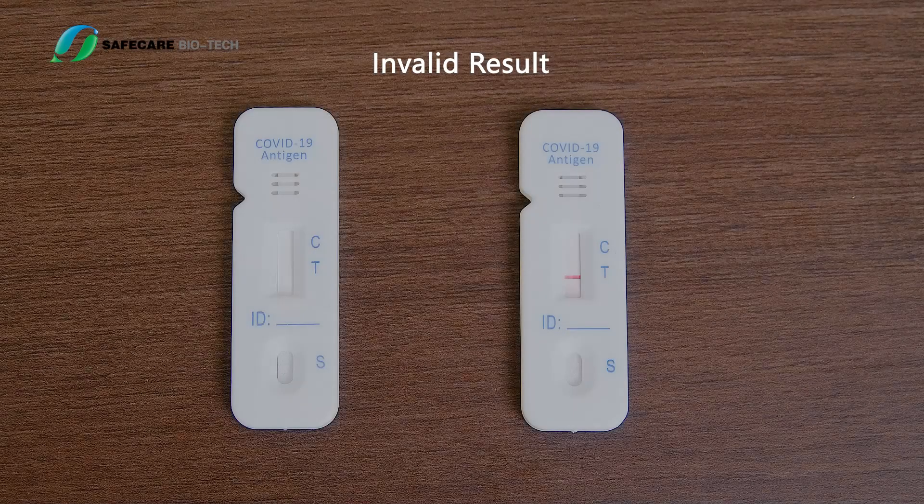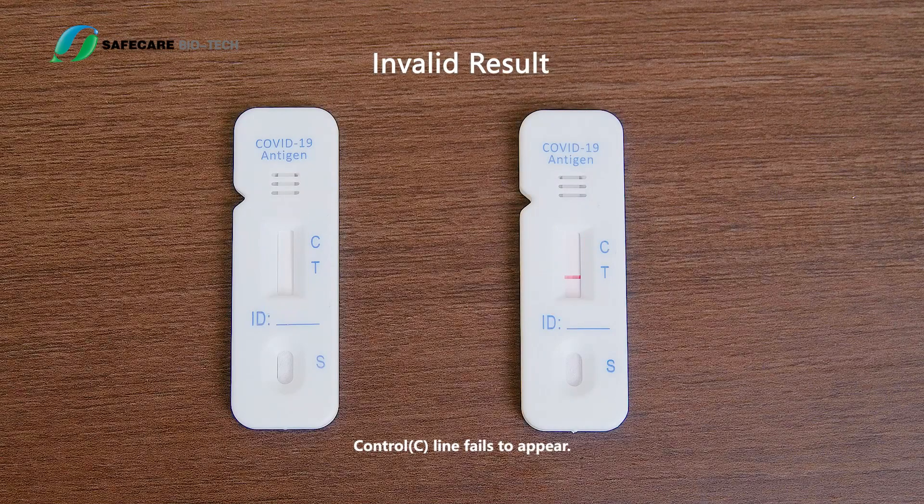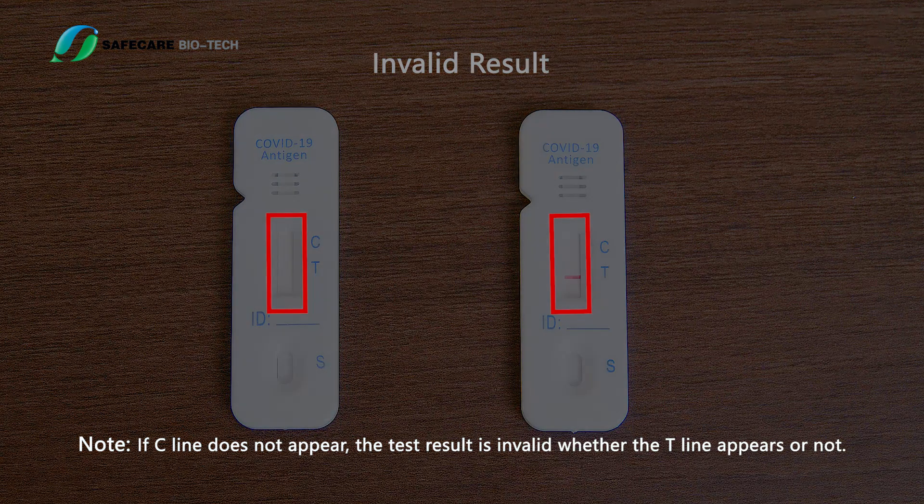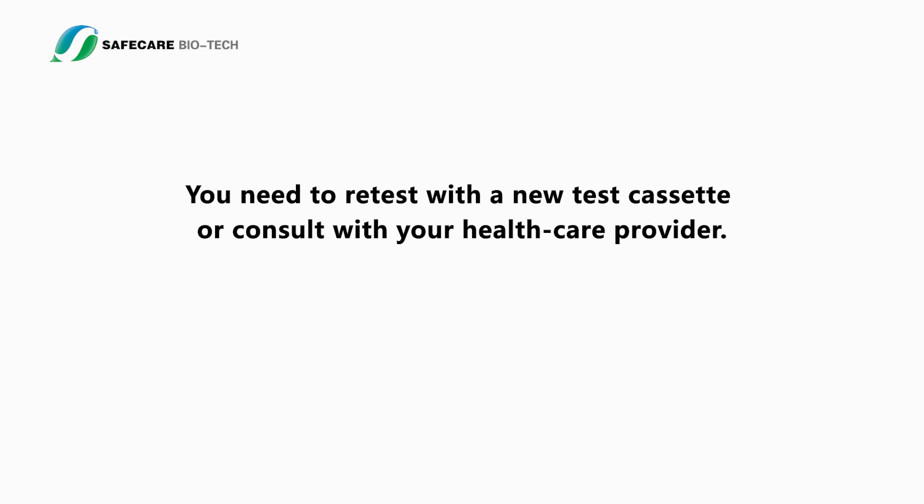Invalid result: The control C line fails to appear. Note: if the C line does not appear, the test result is invalid whether the T line appears or not. You need to retest with a new test cassette or consult with your health care provider.